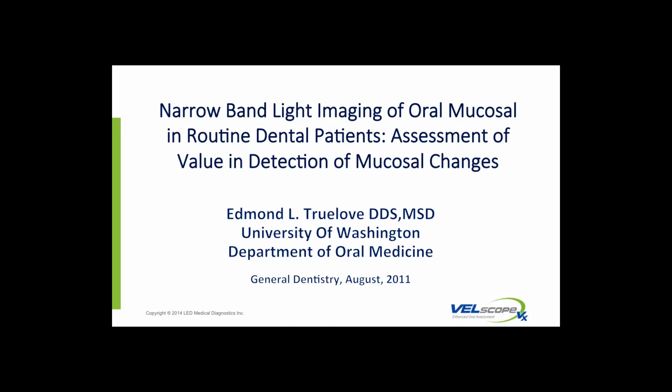I'll just share a couple of them with you, just so that you get a sense of where we've come. This one study was done out of the University of Washington in the oral medicine department, probably one of the most well-respected oral medicine departments in the country. And this was a doctor who I guess was just reserved before making any conclusions. The way the study was set up is that patients were first screened by oral pathologists, oral medicine practitioners, oral surgeons, and surgical residents. And then they were screened by dental students with the VELscope. And then they compared their findings.